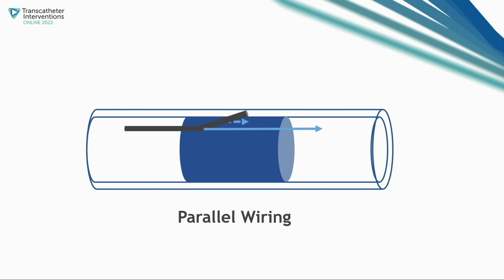You can also, if your second wire is no good, trap the microcatheter out and then re-deliver it on the second wire. And then that gives you another two options from the two side ports again.